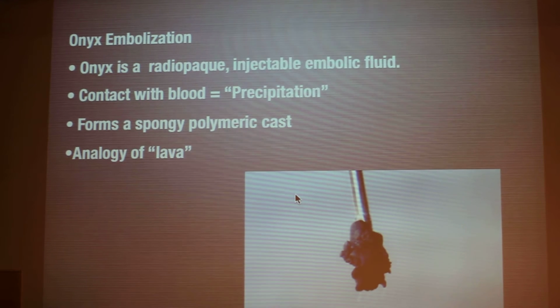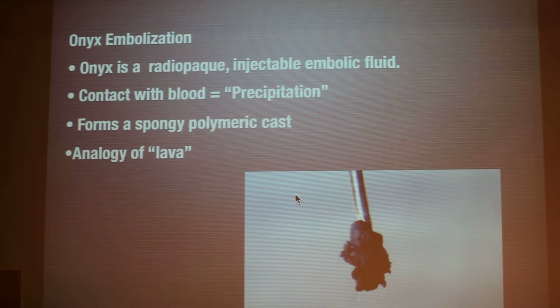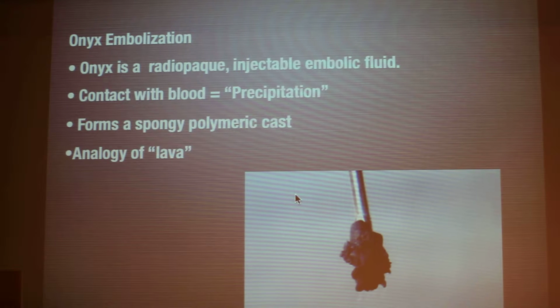Very, in a way it's better, or it's a special material, because you inject it and the minute it touches the blood it precipitates, but in comparison to glue it doesn't become hard. We say it's like a lava. You can push it and it will go further, and you can push it and it will go further.